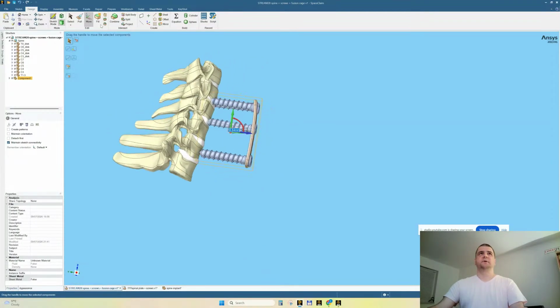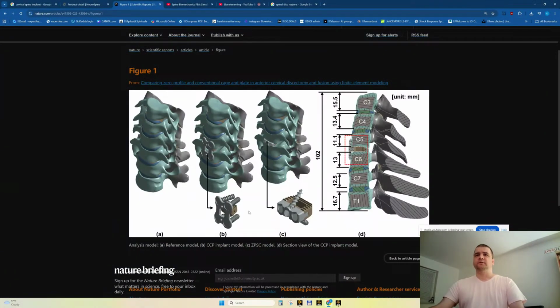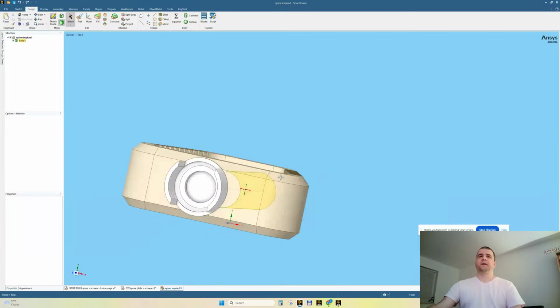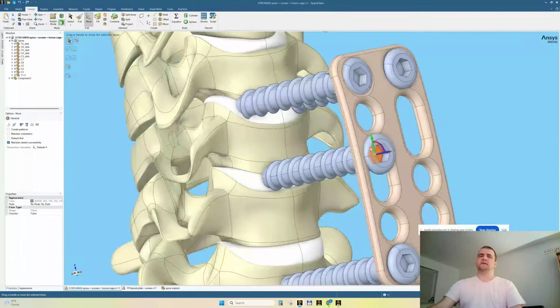Remember the move command, yes? What they have done is, I don't know if they have a screw. No, they don't have a screw. Look here. So there is no screw to edit the tightening or the position of this fusion cage. There are certain plates, for example, my plate, which I think I can modify. Yeah, if there were a screw here, we could modify the configuration of the fusion cage.